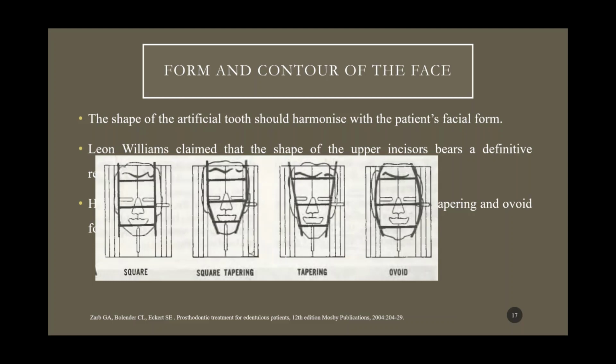And this is positioned by allowing the nose to come to the center of the triangle and centering the pupils of the eye in the eye slots and holding the indicator with its center line coinciding with the median line of the face. Then the form of the face can be observed by noting the characteristic of each form in comparison with the vertical lines of the indicator. In square form, the sides of the face will approximately follow the vertical lines of the indicator, and in square tapering form, the upper third and the lower two thirds will taper inward.